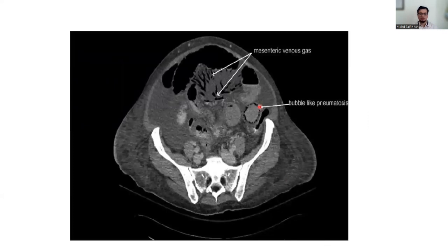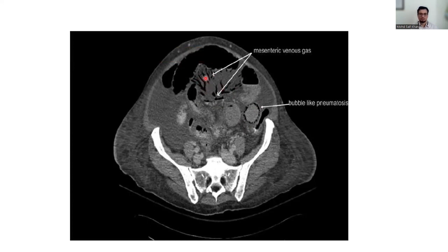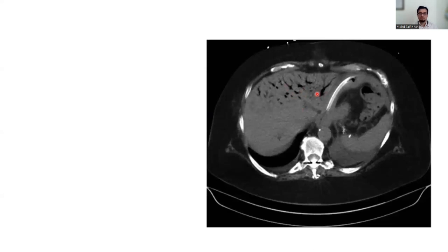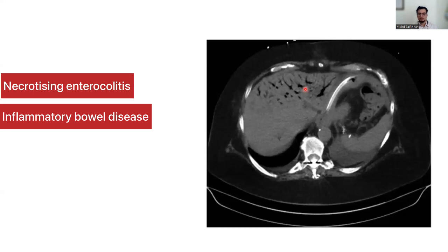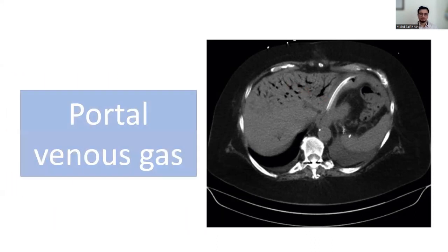In this CT scan you can see intramural bowel gas and also an abnormal branching pattern of air in the mesentery — that is mesenteric venous gas. Sometimes it is associated with hepatic or portal venous gas, which is suggestive of necrotic bowel and requires surgery. This picture also shows a branching pattern of air accumulated inside the liver, more peripherally than centrally — portal venous gas caused by necrotizing enterocolitis, inflammatory bowel disease, mesenteric ischemia, perforated peptic ulcer, or trauma.